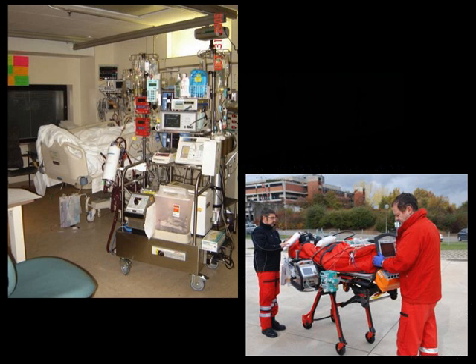Excellent. All of this, except for this device here, which is a little centrifuge, is now in this box, dangling off the side. And this became available in 2010 in Europe. So this was 2003 right here, and this was the setup we used until 2005, and this was the setup we used until 2007. So you can see a dramatic change in the technology in a very brief period of time.